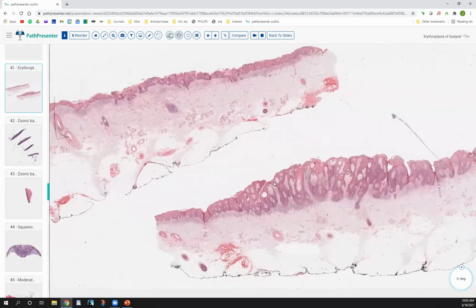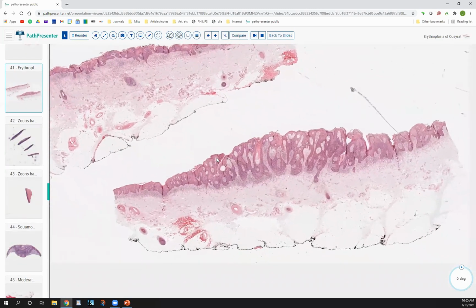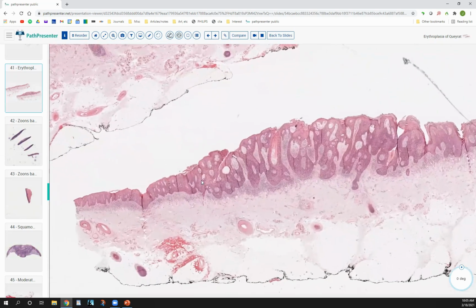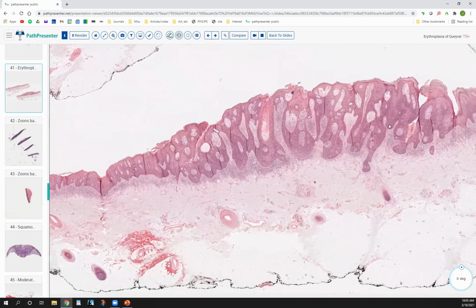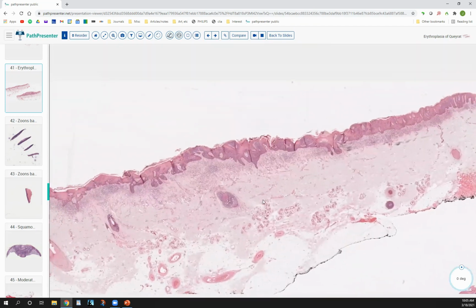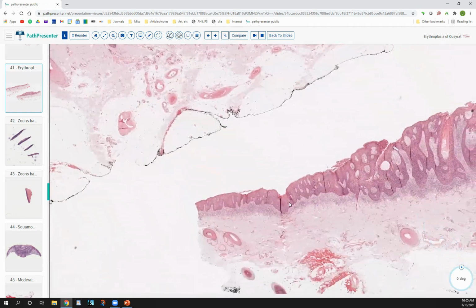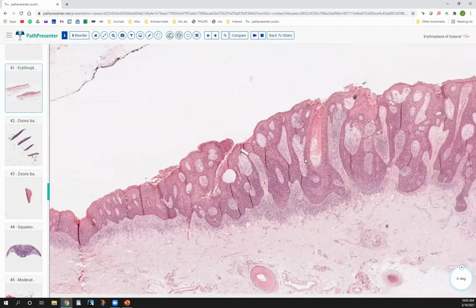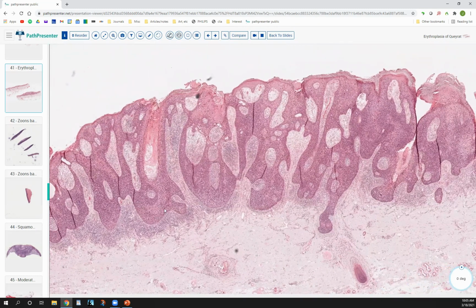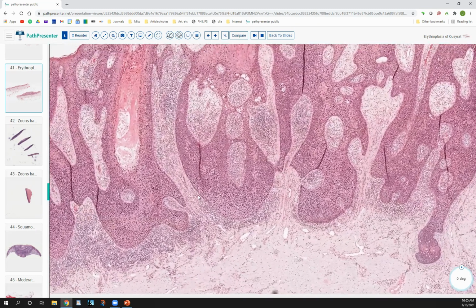So if you have a different anatomic location, you might give it a fancier name. There's lots of names in derm and derm path that we like to give things. And this is one that has the same appearance of what we were talking about earlier, Bowen's disease, the same full thickness atypia, and the same sort of purplish, bluish quality to it, and even the parakeratosis, with the exception that this is from the glans penis.